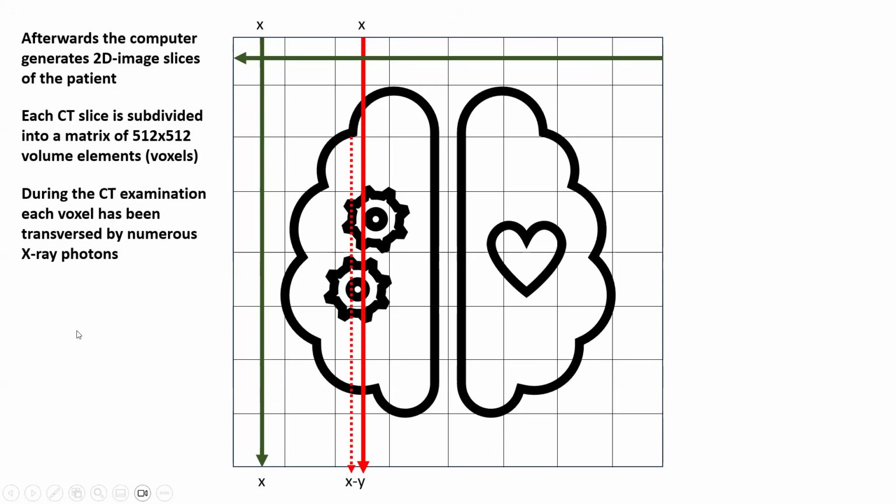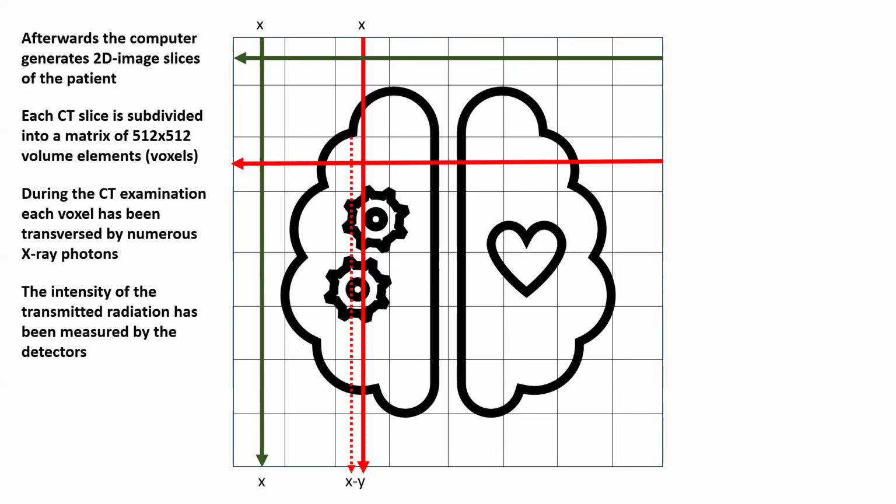How does a CT machine work? Well, basically, we do that operation in multiple directions, and at the end of the day, we get a matrix of values, and then we can calculate for each voxel how much X-ray energy, how many X-rays or photons were actually absorbed or reflected, and that's something we call attenuated in a specific voxel. And that's very interesting.